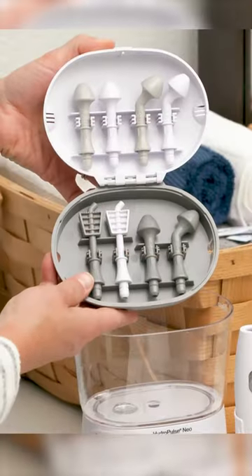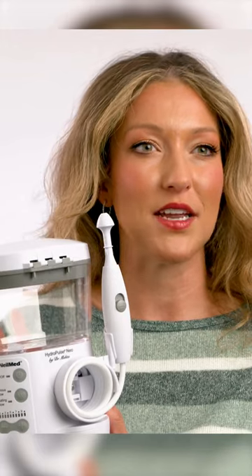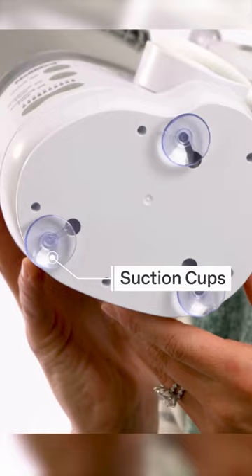The six nasal tips provide options for low, medium, and high flow. We've also updated the HydroPulse Neo with longer, more flexible tubing and base-stabilizing suction cups.